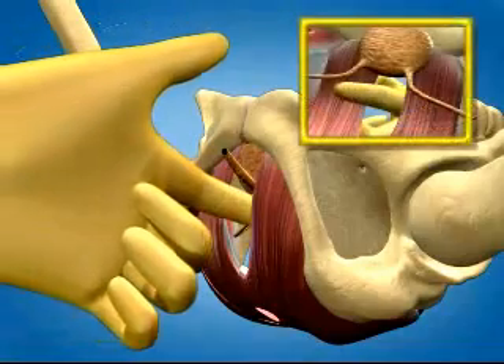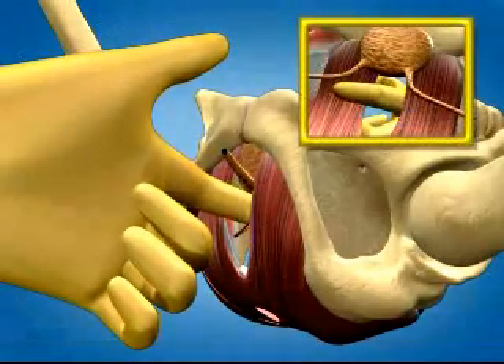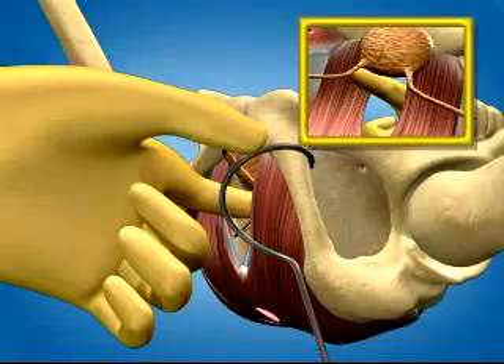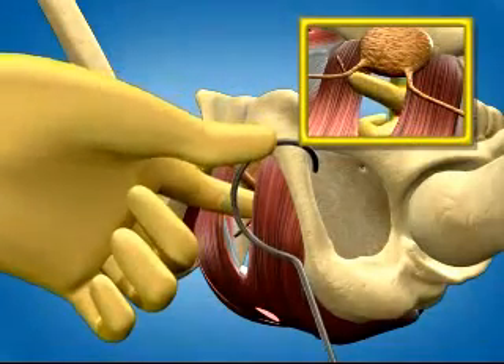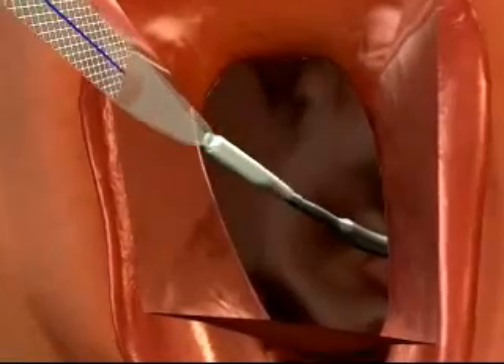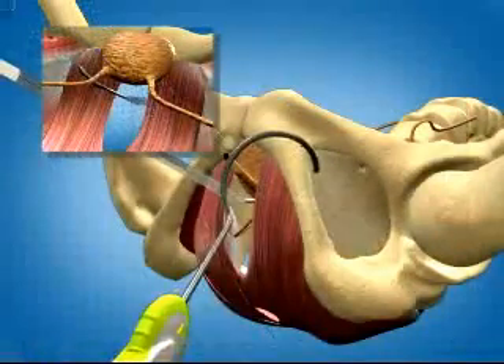There, make a small skin incision where the specially curved BioArc needle will be inserted. With left fingertip in the vaginal tunnel and thumb on top of the needle curve, push the needle tip through the patient's left skin incision. Rotate the needle tip onto your fingertip and toward the vaginal incision. Connect the mesh to the needle and retract through the same needle path.